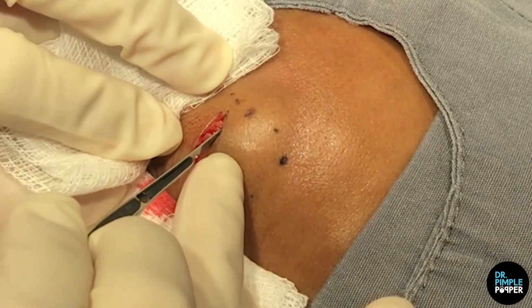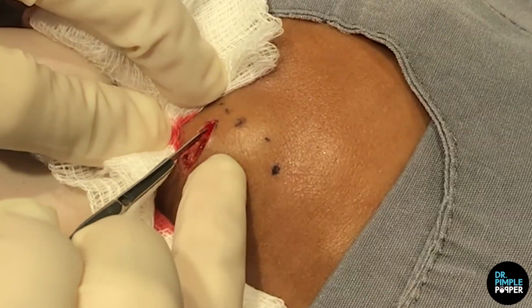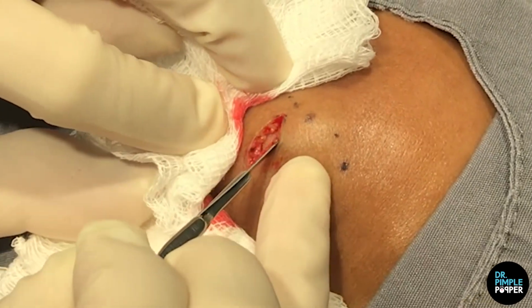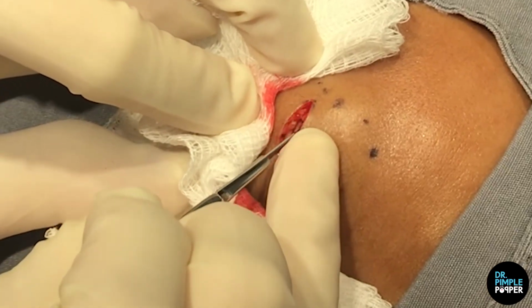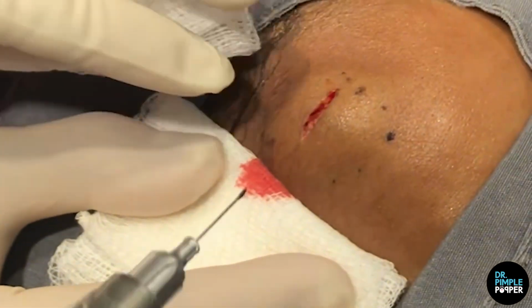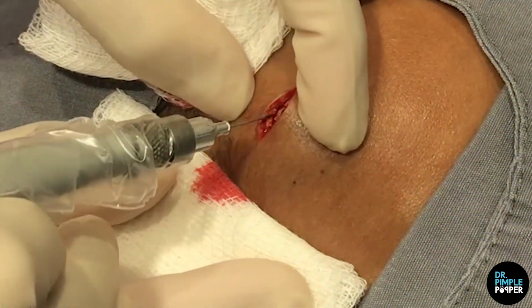As you saw, we let you sit for a little bit because the scalp likes to ooze just a little, nothing crazy, but more so than other areas. If you have kids and they hit their head and say, oh my gosh, I was bleeding like crazy, it's because there's a lot of little blood vessels there. So I like to buzz it because it makes it easier for us to see what we're doing. Okay.